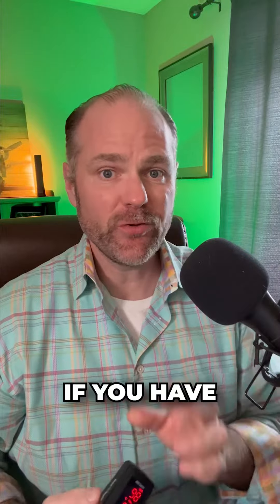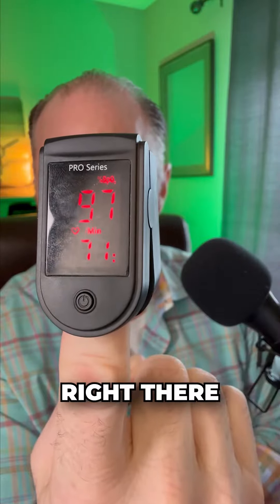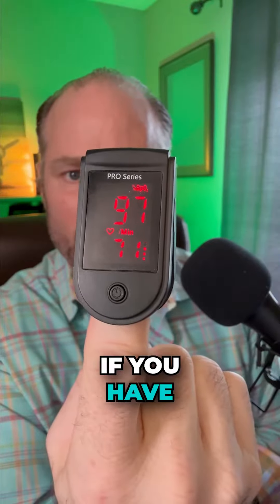This is very critical. If you have dysautonomia, you can have irregular heartbeats. What you're going to do is put this on your finger and see what your heart rate is. You can see right there — mine is roughly 71 beats per minute. You can actually test this at home to see if you have dysautonomia.